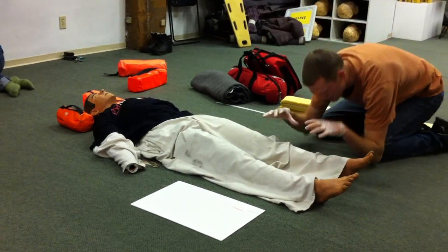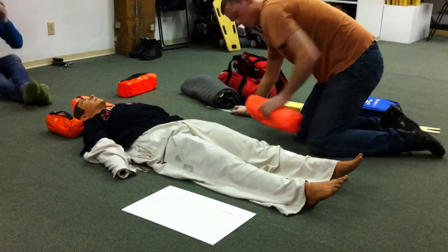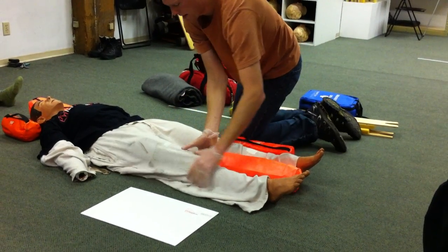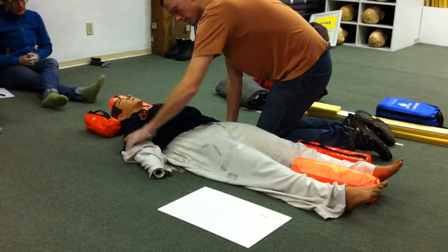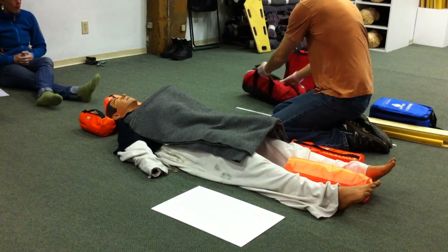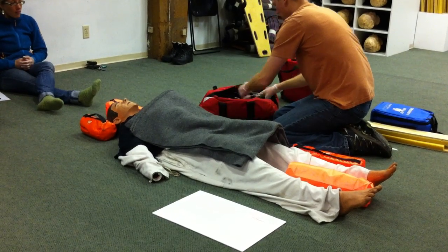Okay, I'm going to get in here. Hold this. Help her get in here and mimic me and hold it. There we go. 1, 2. And then you can feel this below here, Crash? He says yes. How about this leg? Any pain, numbness, or tingling over here? And he says nope. Same thing for the arms, any pain, numbness, or tingling, and nope. Okay, so what we're going to do here, Crash, is I'm going to cover you up in a blanket, be able to watch you, make you feel better, and then we're going to get into checking that leg out.